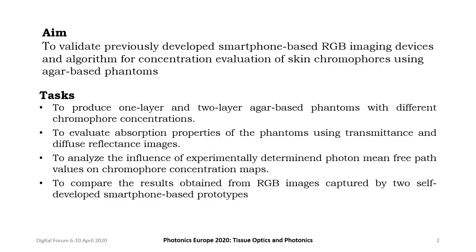The aim of this study was to validate previously developed smartphone-based RGB imaging devices and algorithm for concentration evaluation of skin chromophore using agar-based phantoms.